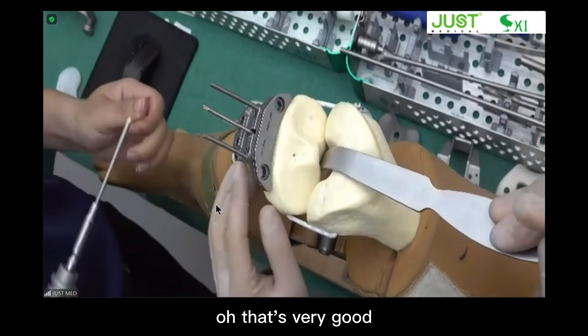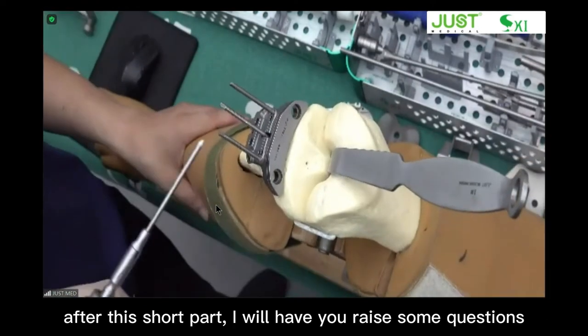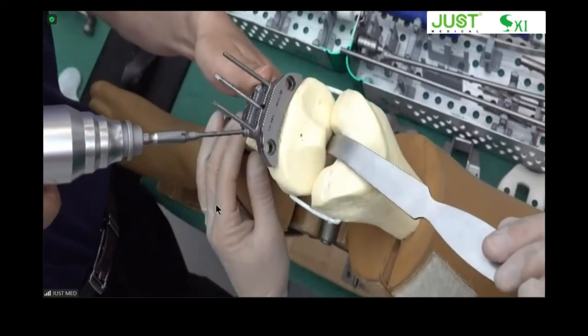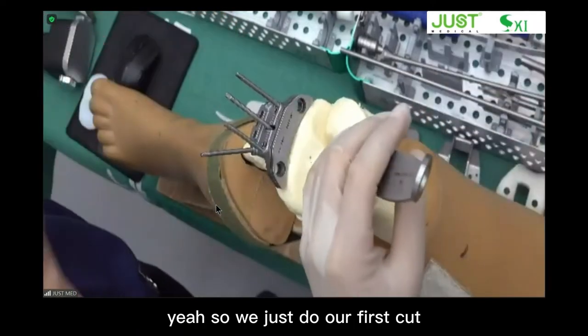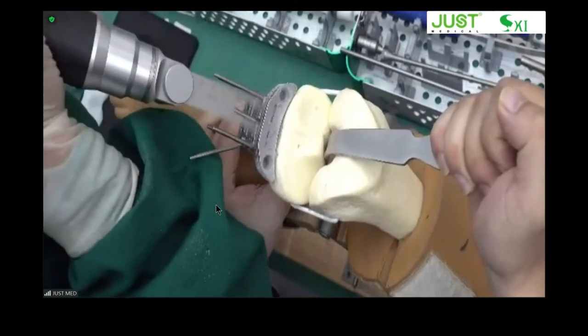Oh, no, that's very good. After this short part, I will have you raise some questions. Yeah, so we just do our first cut. It's a sawbone imported from the US.